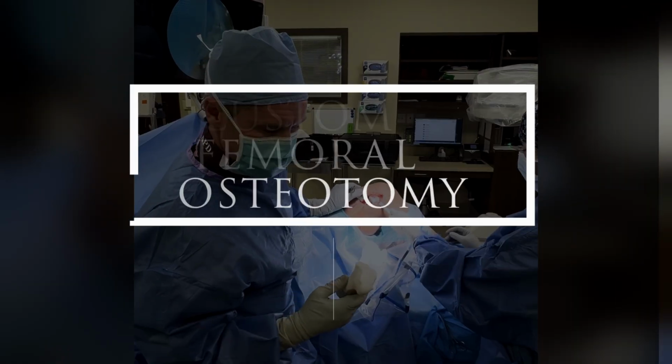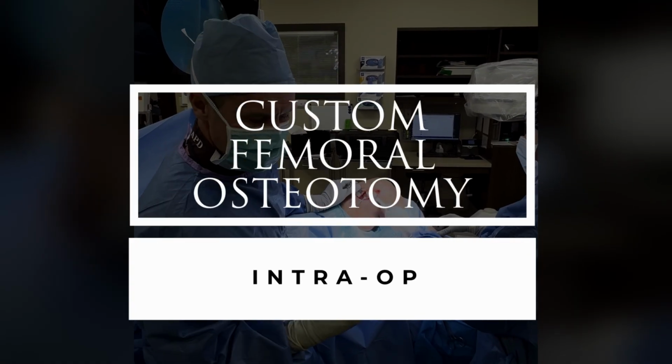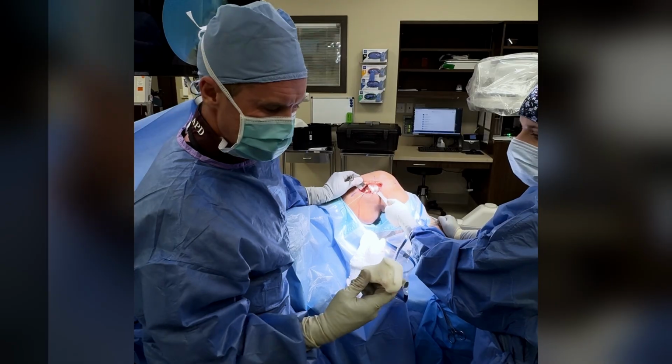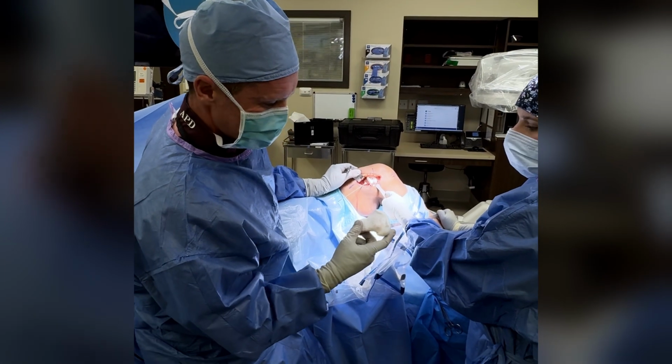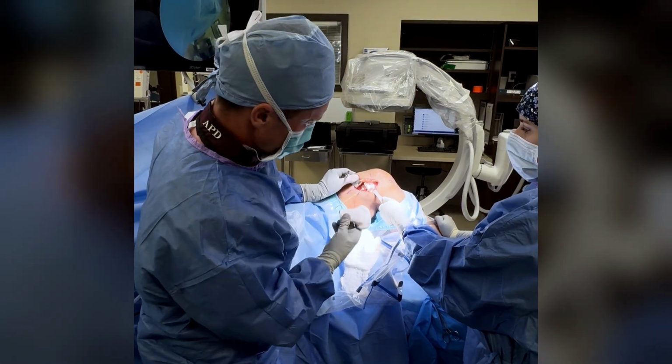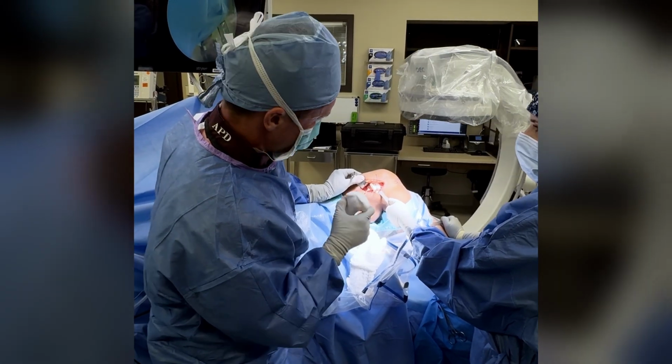So we're in this osteotomy case. Here's our model, a 3D reconstruction of the patient's distal lateral femur made with a CT. This is an exact replica of her distal femur. There's our cutting block, which we first started with here, and then we went there.